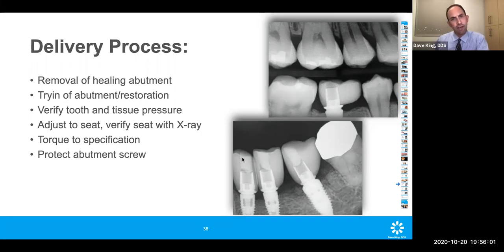I don't do that. I've had, I don't know, half a dozen or so, not a ton, but I've had a lot of patients come back who have had that temporary cement fail and then we need to re-cement it again. It's just fine, in my opinion, to use conventional cement. If I ever were to need to recover that, I could always open an access hole and unscrew the whole thing in one. But I use regular cement, whatever you normally use, which for me is Link Esthetic.